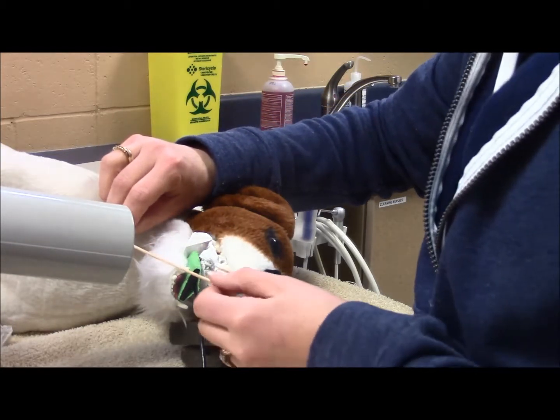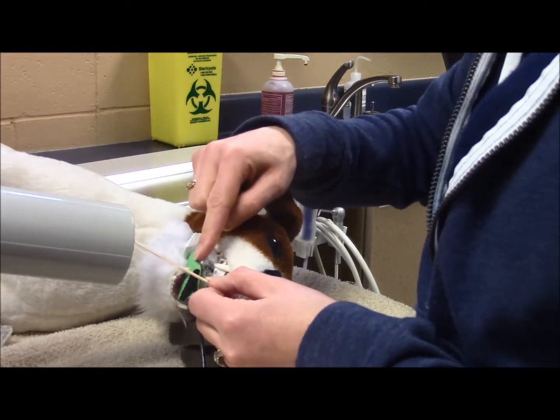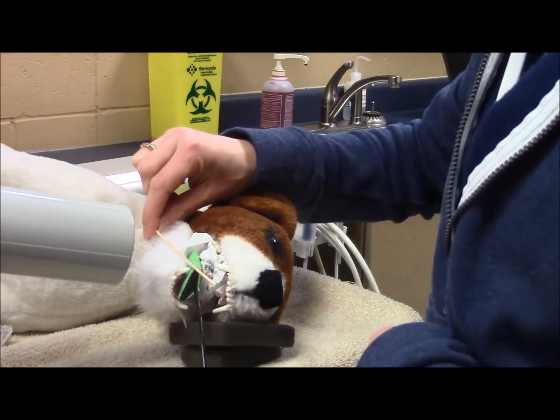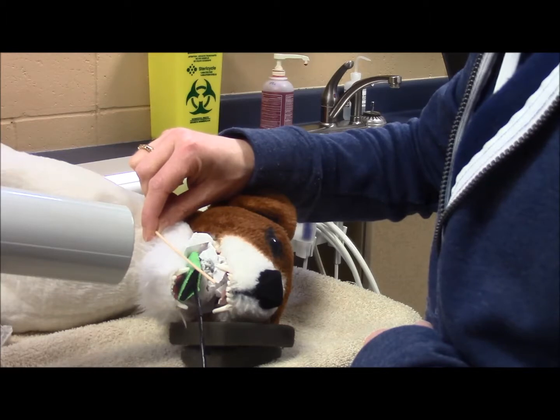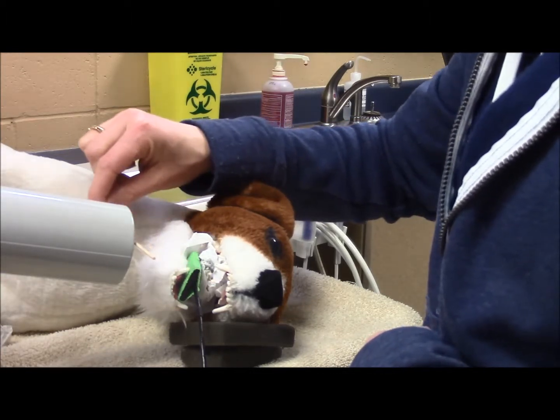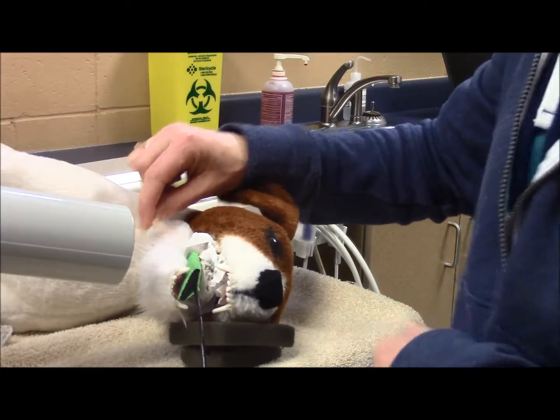So I've got the long axis of the tooth. I can see the edge of my sensor. So halfway in between is my bisecting angle. And I want to ensure that my cone is directed right at the bisecting angle as I visualize it from the side of the patient.